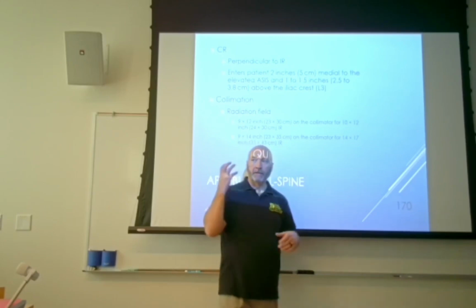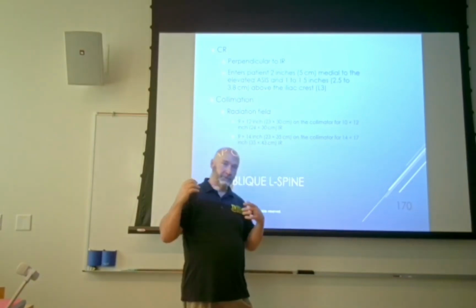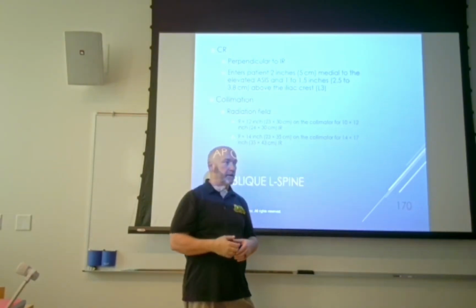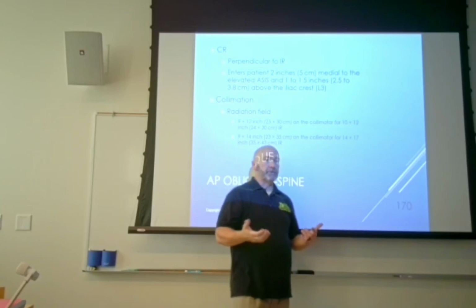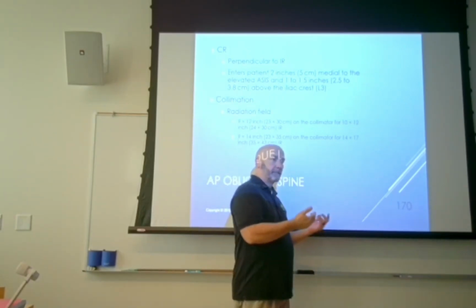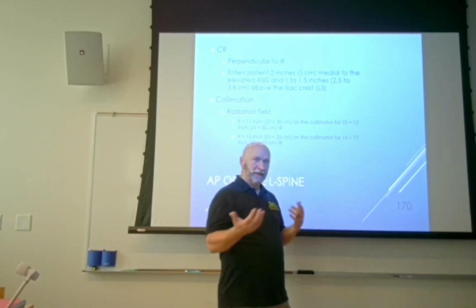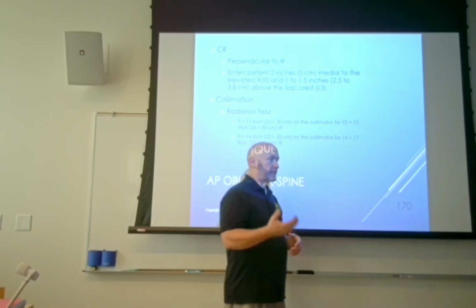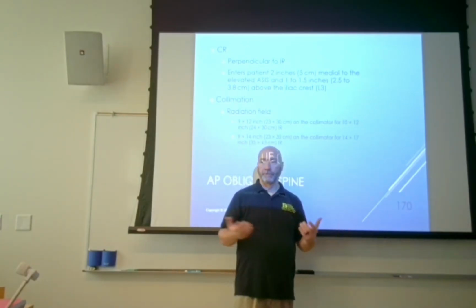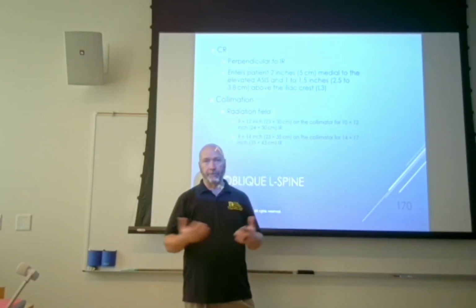So your spine doesn't go just, C-spine, blam, T-spine, shazam, L-spine. There's a slow curve from one end to the other. So naturally, if you're looking at the upper portion of the L-spine, you might need a steeper angulation than what you would at the lower portion. So if you happen to read that in a textbook or in DeAngelis or some registry review book, that's what it's referring to. I think Merrill's just comes down with 45 degrees.